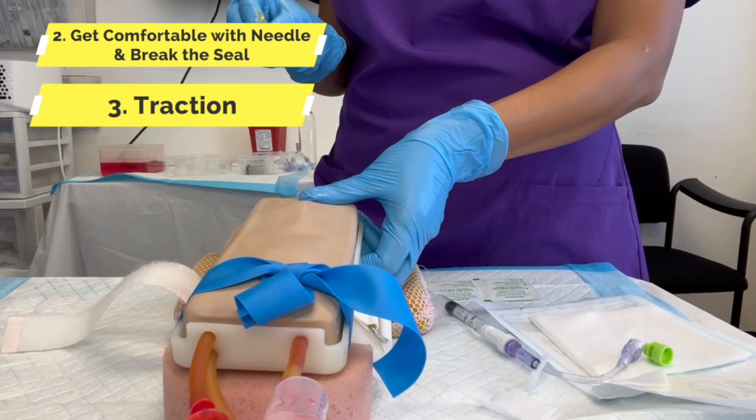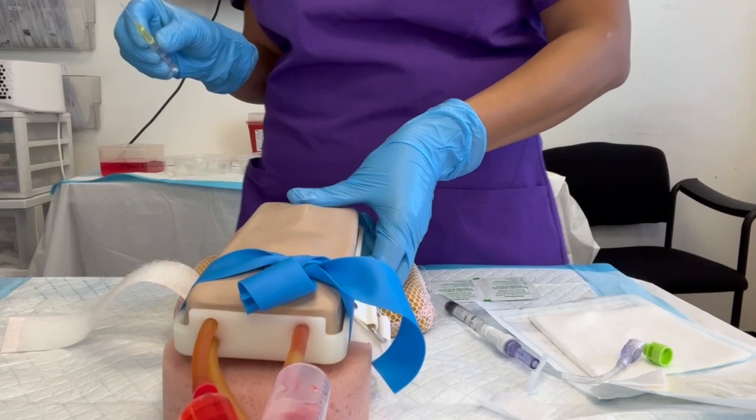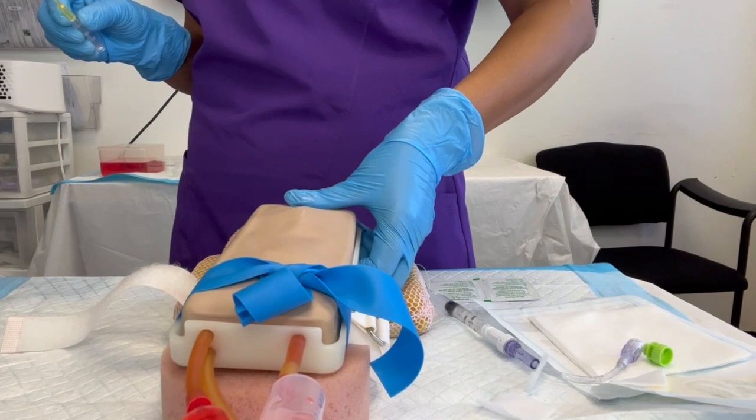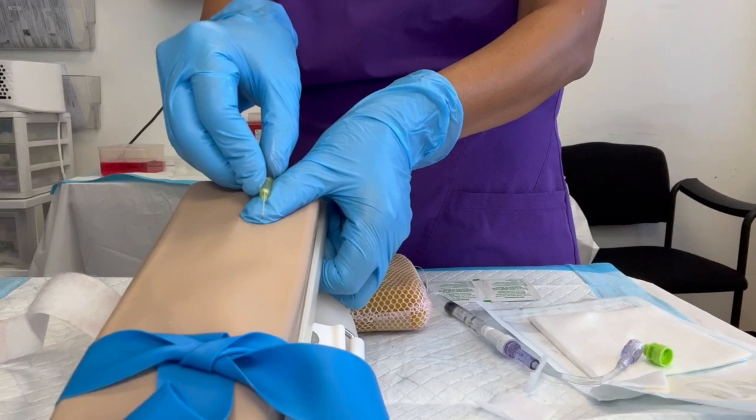Step three: traction. What is traction? It's the pressure you exert with your thumb — because that's the strongest — to keep the skin tight, pulling towards you. The traction cannot touch the needle with your thumb. I don't want to see it go in that direction. The traction should be out of the way.